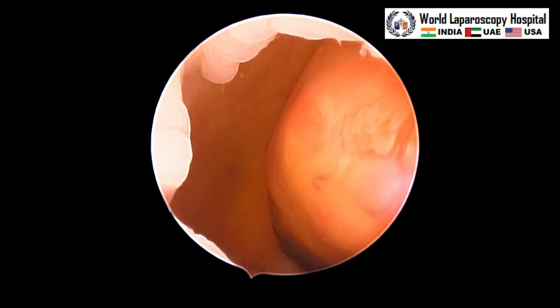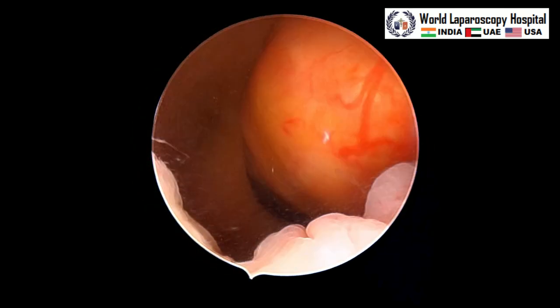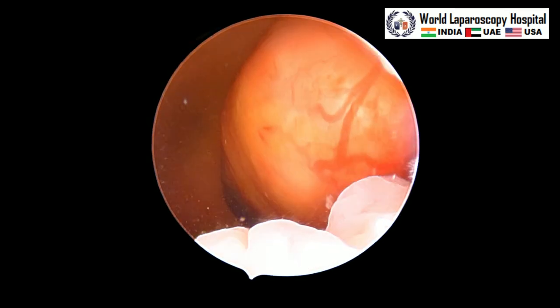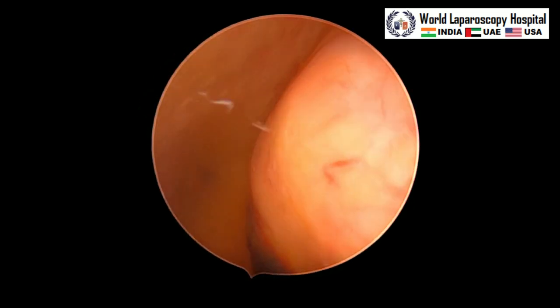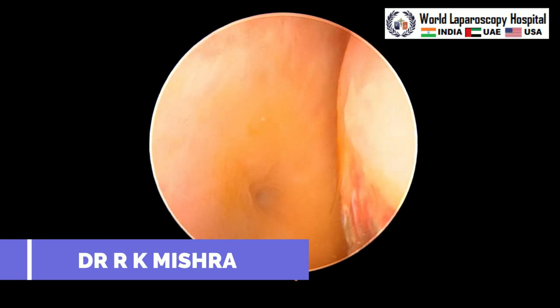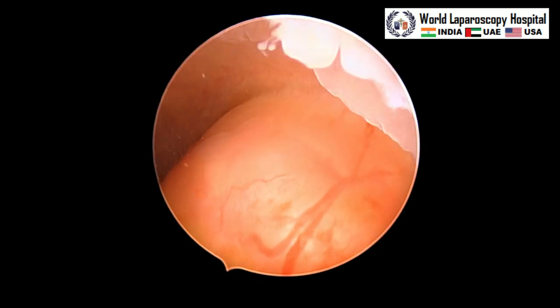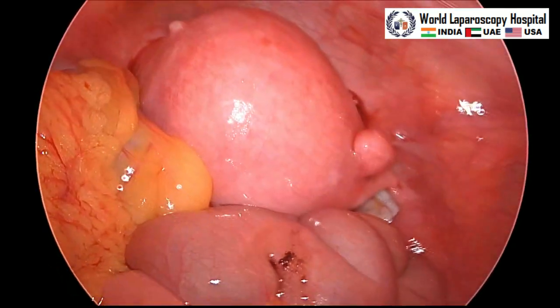So here we can see this is a large myoma inside the uterine cavity. It is almost occupying the entire uterine cavity. It is attached to the anterior wall, we can see here. So in that situation, this is a large myoma, so it is better to do this. This is the ostium. Ostium is good. This is the right ostium. It is visible. Then we will plan here to perform the laparoscopic myomectomy.